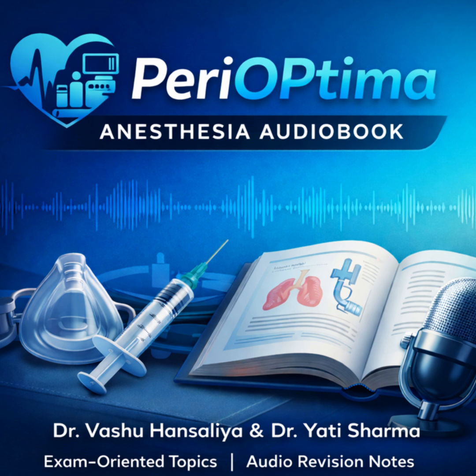Next pair, AC versus SIMV. AC. Every single patient trigger results in a full, mandatory machine breath. It's great for resting the muscles, but it carries a high risk of hyperventilation and breath stacking if the patient is tachypneic. SIMV. Only the scheduled mandatory breaths are full machine breaths. In between, the patient takes their own spontaneous breaths. It was thought to be good for weaning, but it may actually fatigue the muscles.